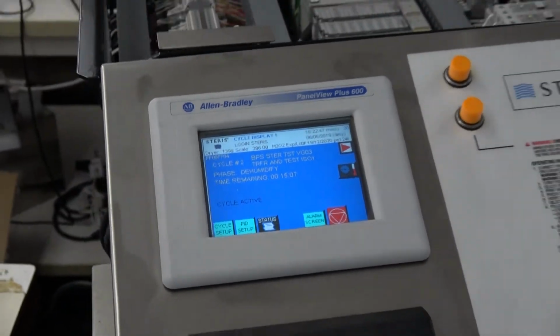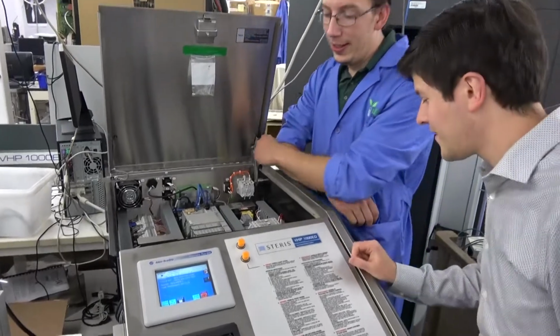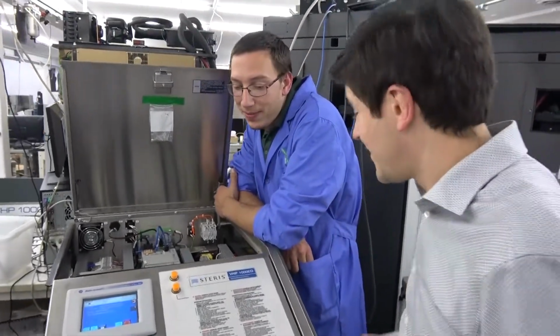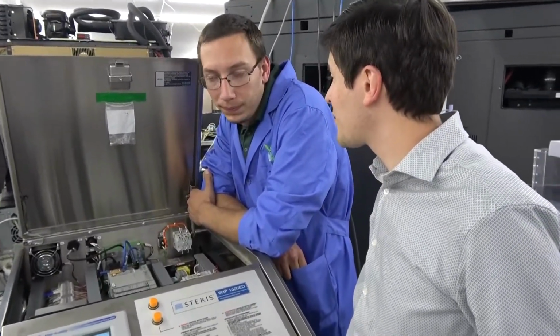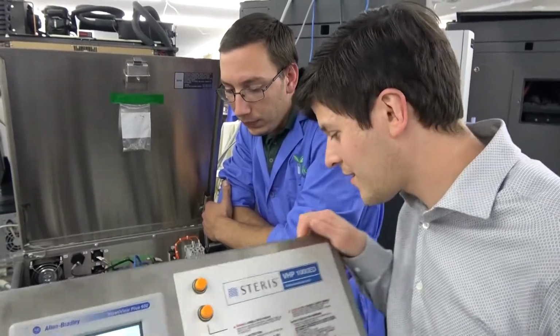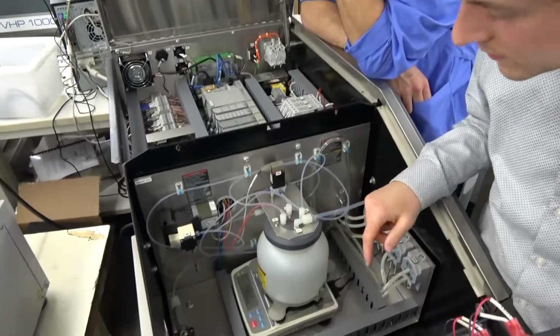So what's cool about this? What can you tell us? Why is there a scale on the inside? Good question, right? To measure the hydrogen peroxide. Really? It measures the dosage of hydrogen peroxide coming through the system? Yeah. How frequently is it measuring? Just when it has to pump the hydrogen peroxide in.